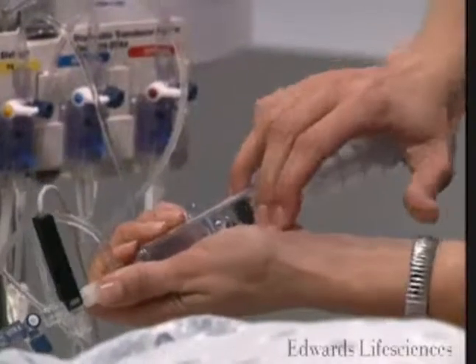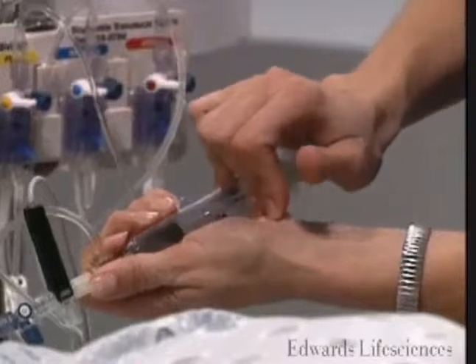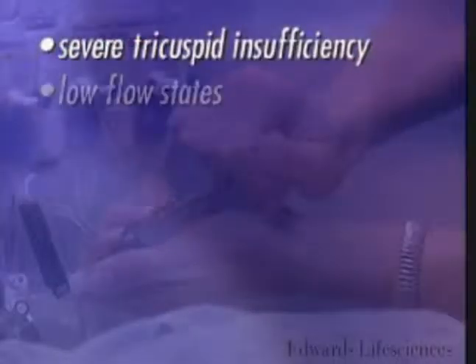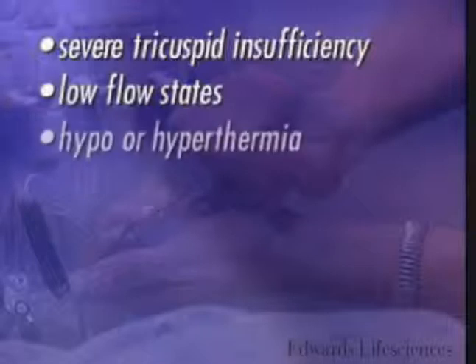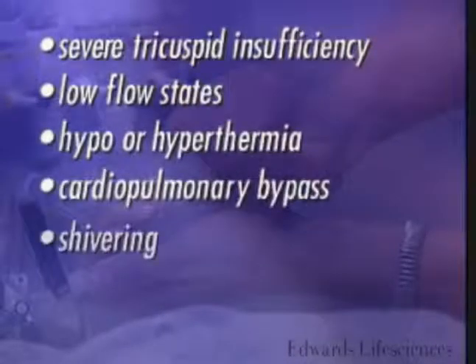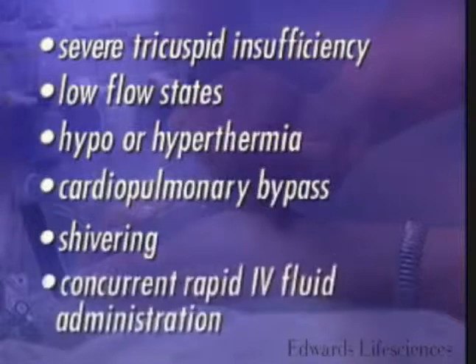Bolus thermal dilution should be interpreted cautiously in patients with the following clinical conditions: severe tricuspid insufficiency, low flow states, hypo or hyperthermia, cardiopulmonary bypass, shivering, concurrent rapid IV fluid administration.